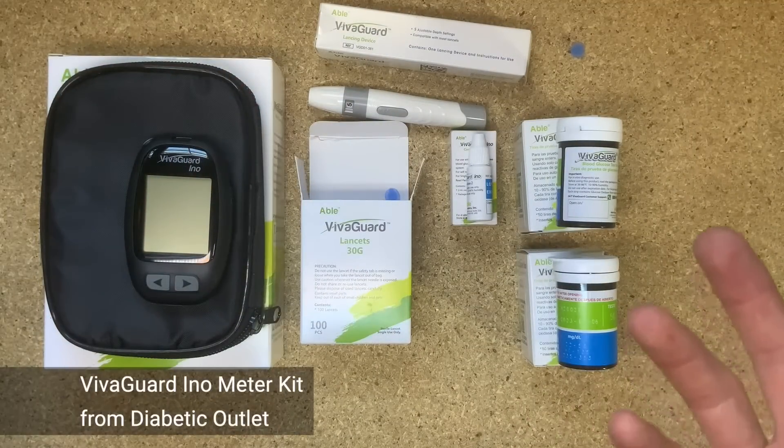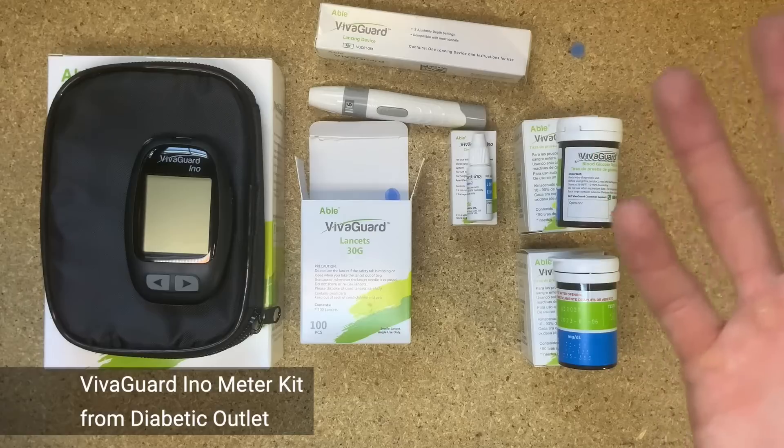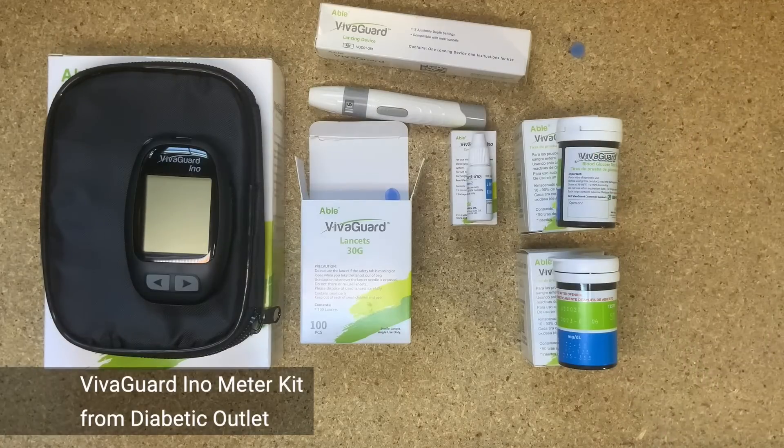So that's the VivaGuard Eno. Complete package. Great price. Works well. We've been really happy with it, and we expect to see a lot of these going out the door.